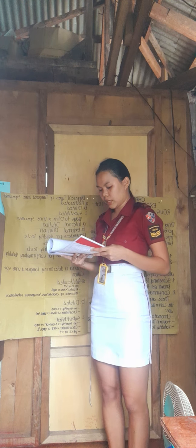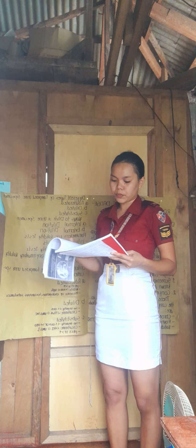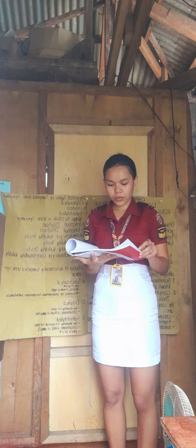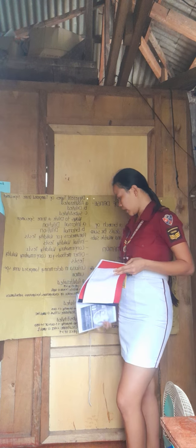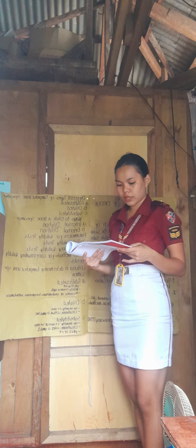Criteria in determining tampered urine specimen. So, there are three criteria: adulterated, diluted, and substituted. So, as you can see, these are the criteria in determining tampered urine specimen.